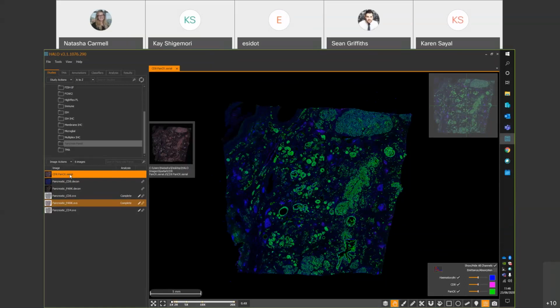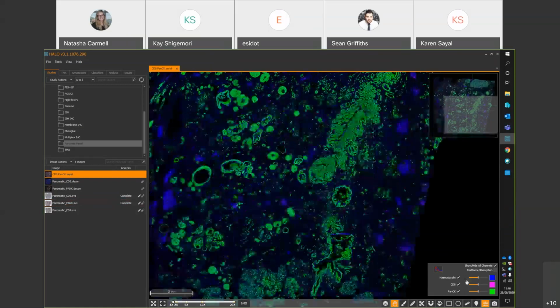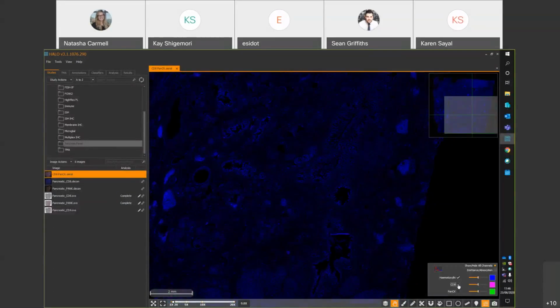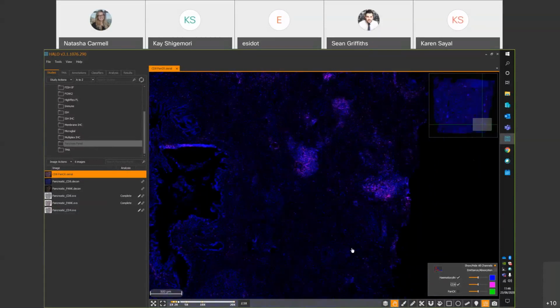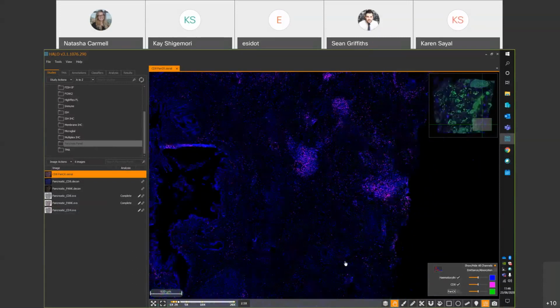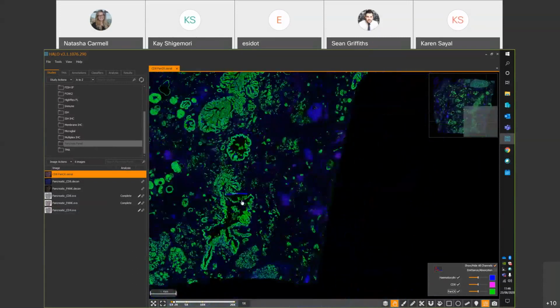Sometimes we've had difficulty in the past with people wanting to maybe reduce a bit of time they're waiting for the TIFF image to be generated, but we really don't recommend analysing this .serial image. Check your registration, make sure you're happy, and then you can go ahead and fuse into that .tiff image. But just as a reminder, you can toggle any of these off and on as you would with a normal fluorescent image. Really zoom in and make sure you're fully happy before you want to generate that TIFF file.